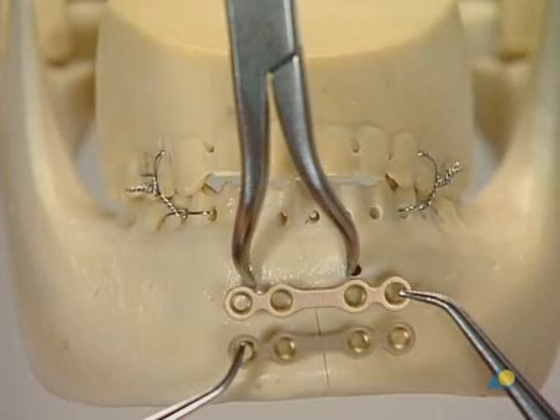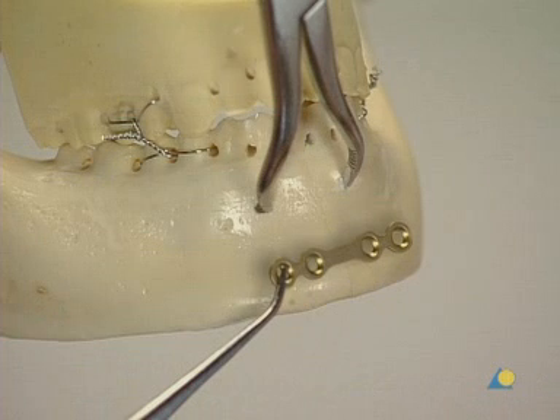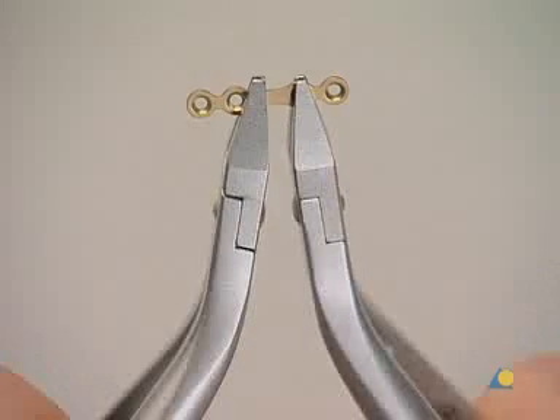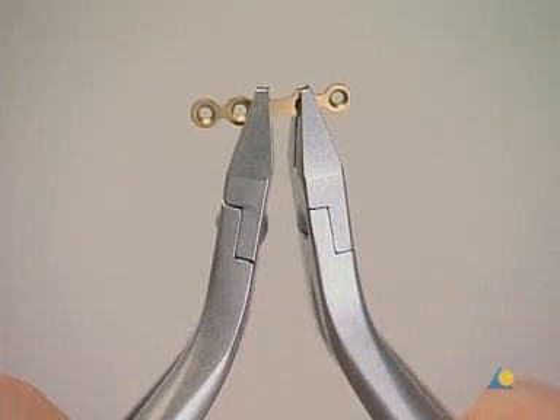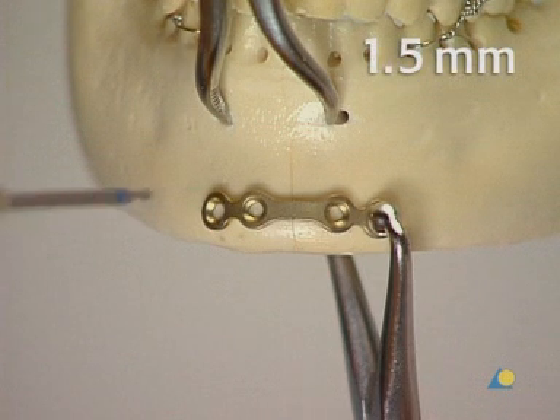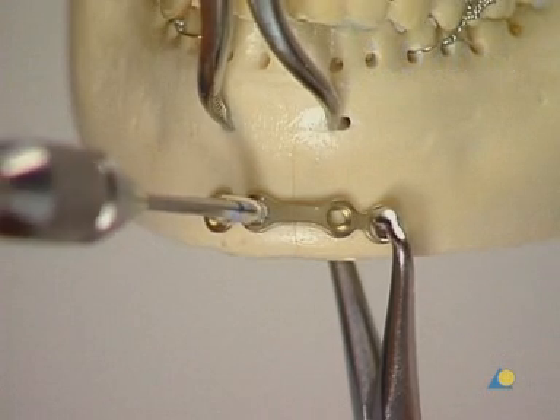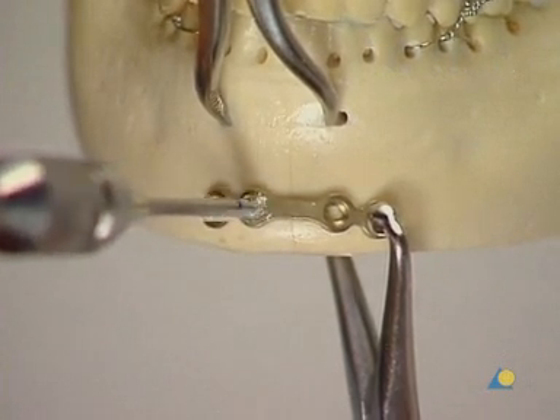This fracture is to be repaired with the two-plate technique. The first four-hole 2.0 mandible mini-plate is applied to the inferior border of the mandible. The plate is contoured with the bending pliers and positioned a few millimeters superior to the inferior border. On the bone model, the holding forceps with ball tip is used. A 1.5 mm drill bit with 6 mm stop is used to drill monocortically through the plate hole next to the fracture.